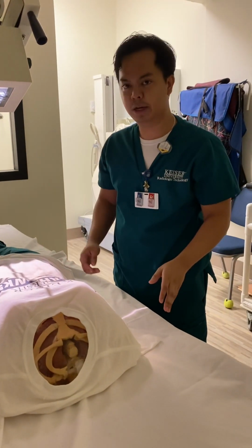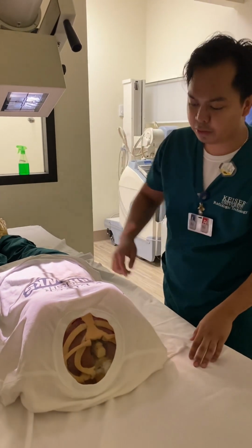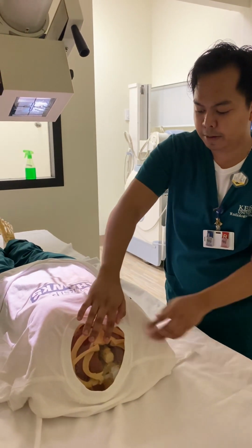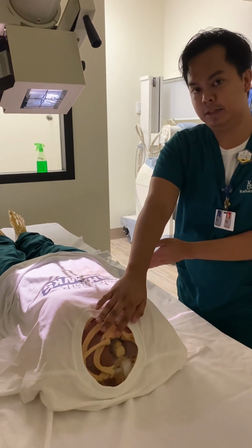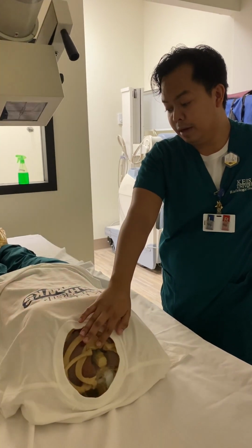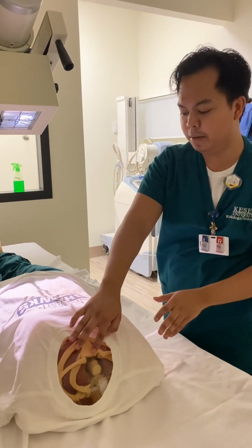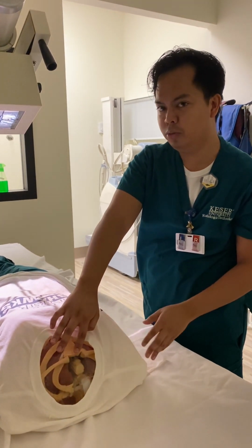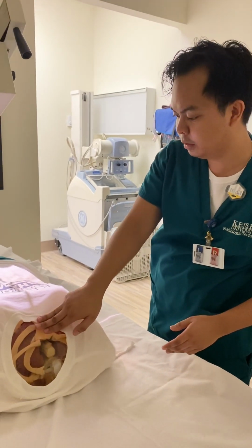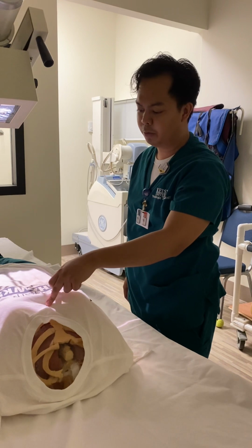It's centered. Next, you will have to do their CR, their central ray. To do that, you will have to feel their jugular notch, which is right here. For central ray, it will be at T7, or if it was a PA, it will be your inferior scapula. Since you're doing the lordotic or anything AP, you will feel their jugular notch, and it will be 3 to 4 inches below that. So I'll just take my fingers here, feel this, go up here. So my central ray would be right here.